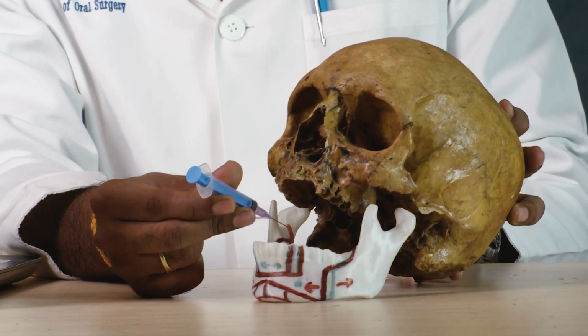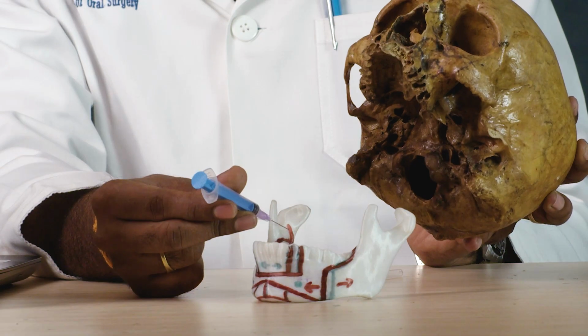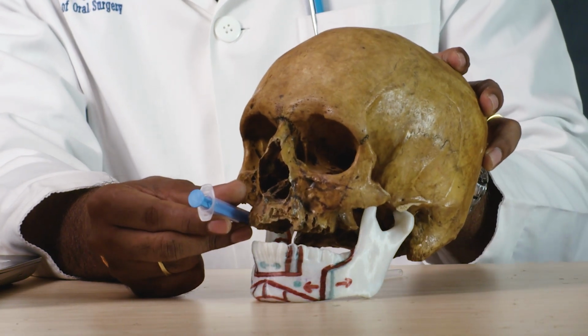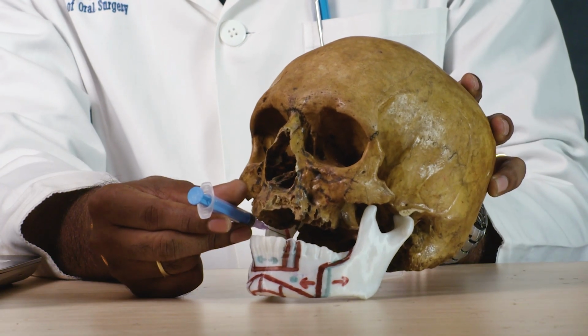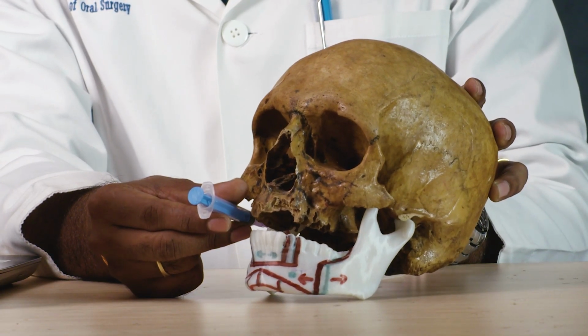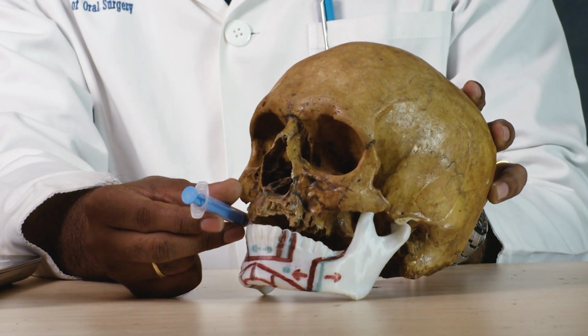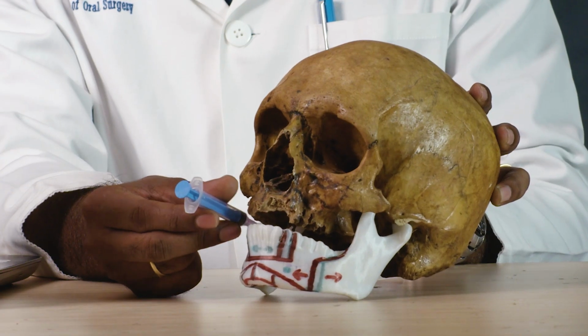So, here upon insertion you can see the needle is located almost near my inferior alveolar nerve region. So, once the adequate depth of insertion is achieved, do the aspiration. Once it is negative, slowly deposit about 1.5 to 1.8 ml of solution over 60 seconds.